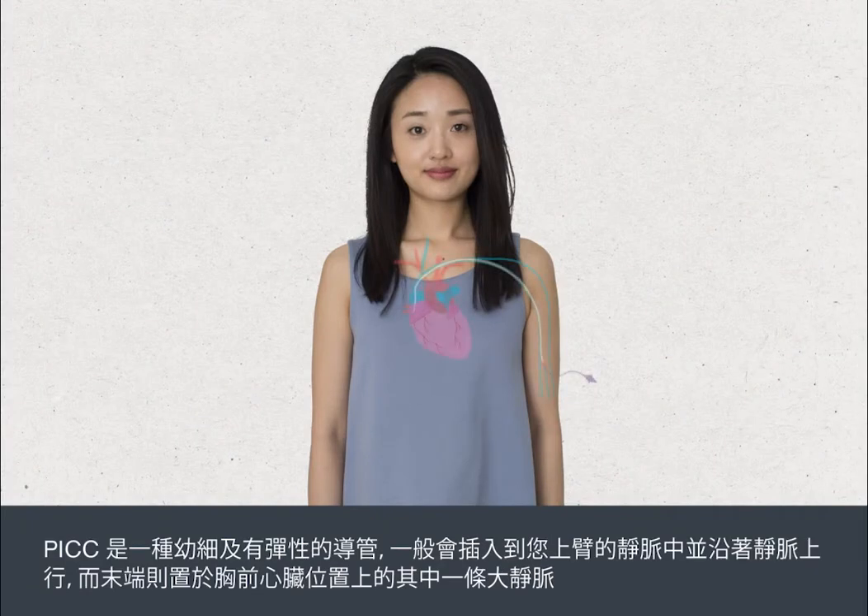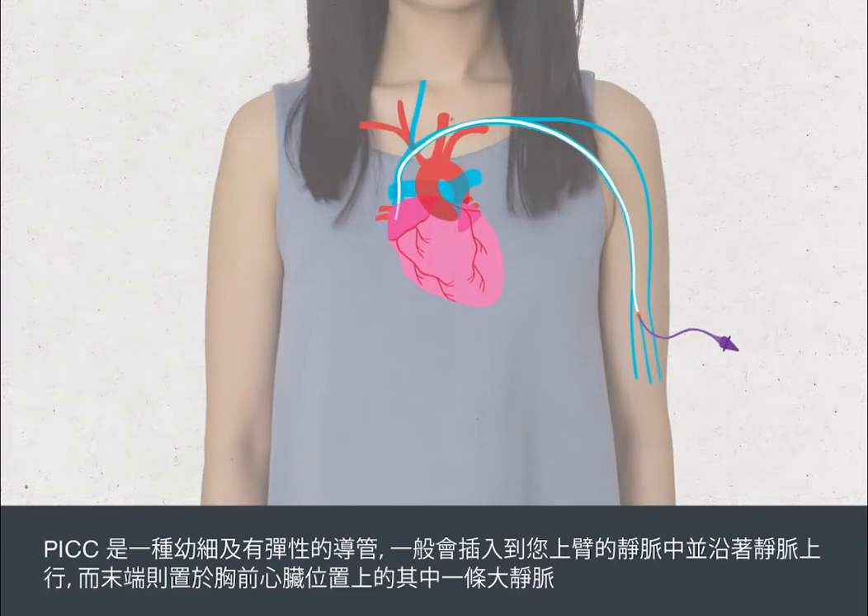A PIC is a thin, flexible tube that is inserted into a vein in your upper arm, threaded along the vein so that the tip lies in one of the large veins in your chest, just above your heart.